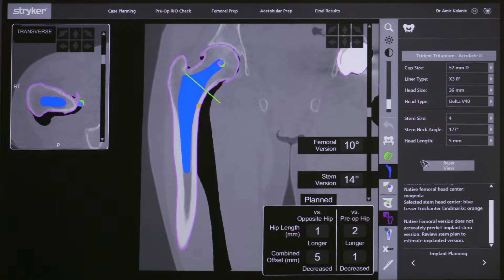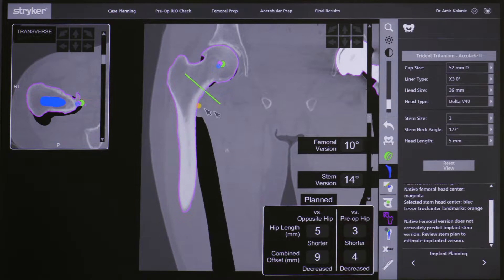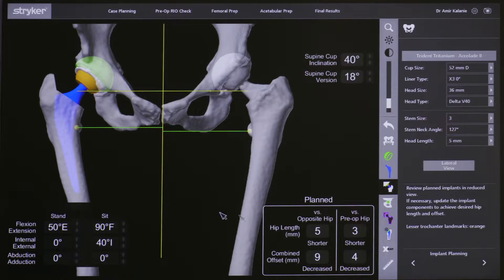Attention is then turned to the femoral side. Here I can assess the femur in three dimensions and choose the correct size stem for the specific patient. I can move the stem up and down to increase or decrease the leg length, and I can also adjust how far the femur sits away from the pelvis by choosing different angles of the femoral neck.